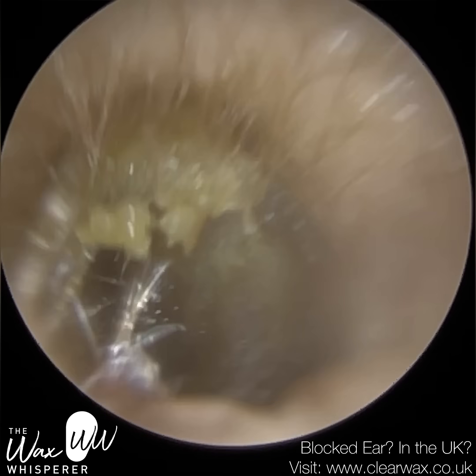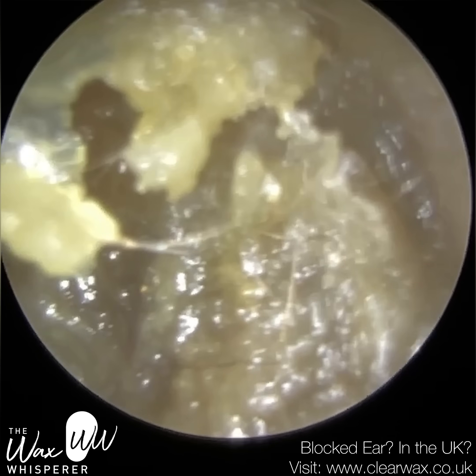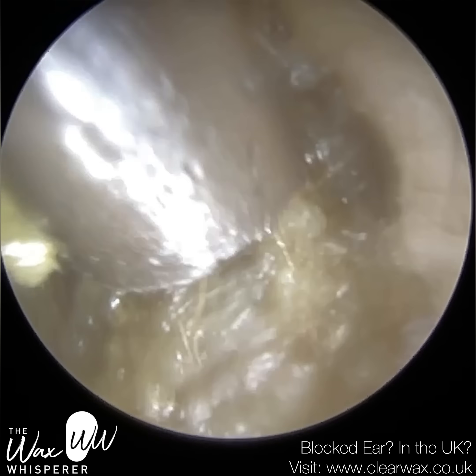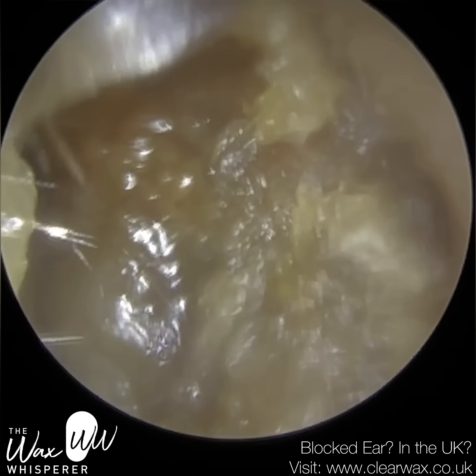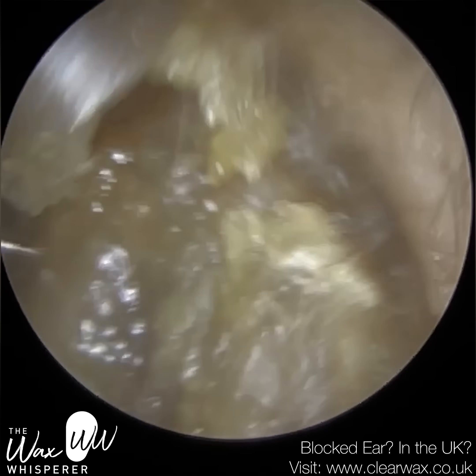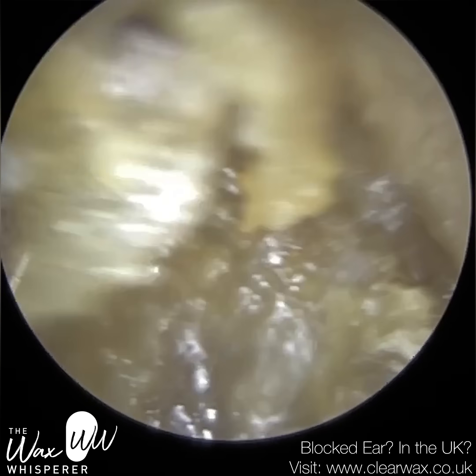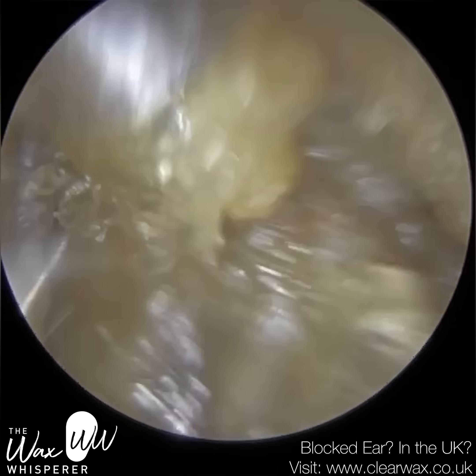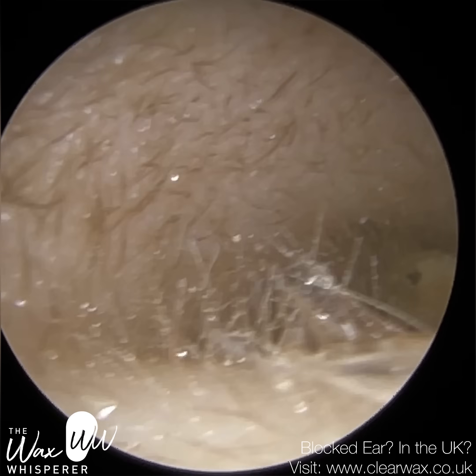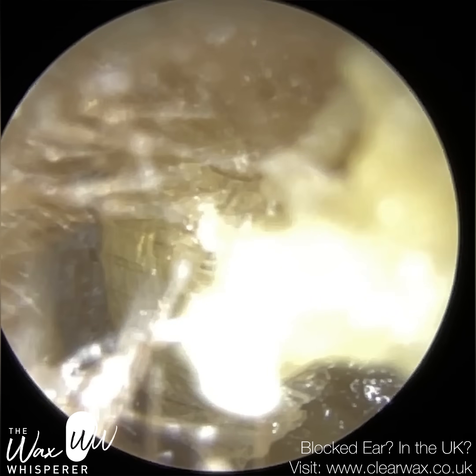This is the patient's right ear — this thankfully came out with relative ease. You can see the skin; they had been using sodium bicarbonate for a couple of days prior to attending. Here I'm latching on to some of this dead skin — you can see I'm suctioning with the forceps. Fortunately, the plug came out in one segment, and then there was some crusted dead skin that peeled away. So, keratosis obturans in my experience is more common in patients between the age of 20 and 40.